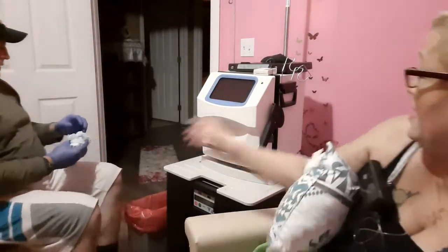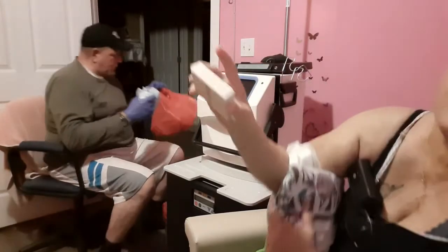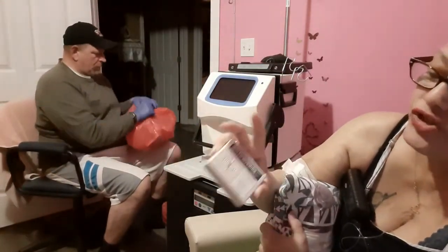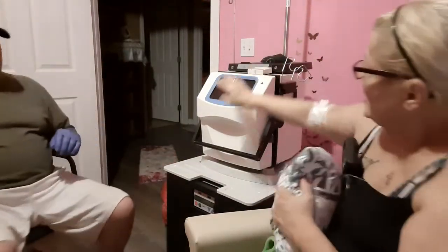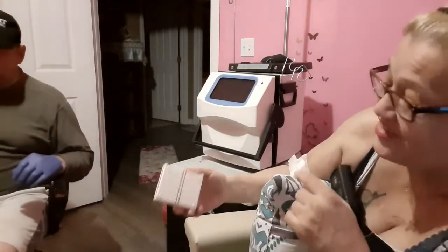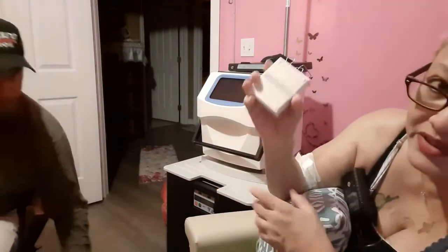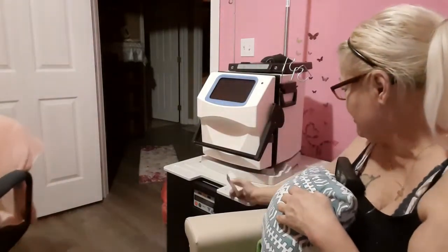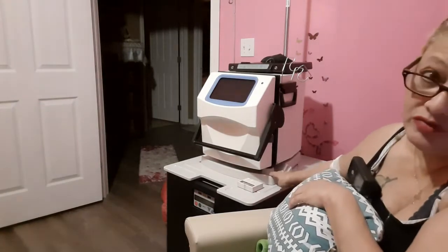We are done. Hubster has closed the cycler door. He removed the fluid detection sensor from its cradle so that we don't forget to check it in the morning. See, Hubster had just cleaned that, so it was still moist. That's how sensitive this is. But anyway, once it air dries, we'll go ahead and sit it down here if it's not wet. That way, we'll know to test that. Because if it sits in the cradle, more than likely we could forget to check it.